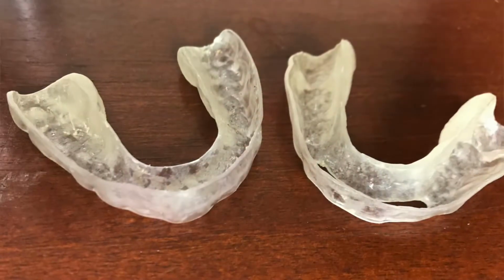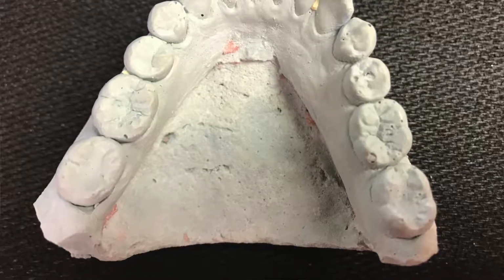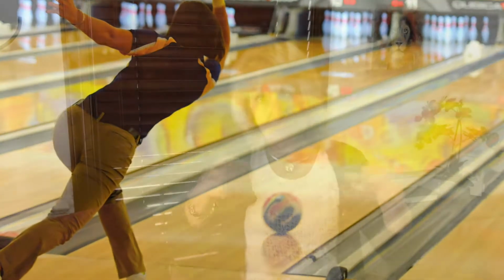Visualize that it is an arch. I want to make these explanations ahead of time because he had to move them around, because the tongue can move the back teeth out. And you need to make an alley as if it is a bowling alley. Visualize that. A bowling alley, when you put the gutters up, the way I bowl, so that the ball doesn't go into the gutter rails. Visualize that, because that is a very good analogy of what he is doing.